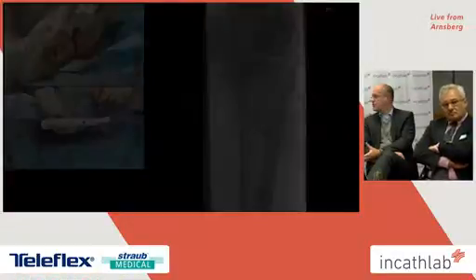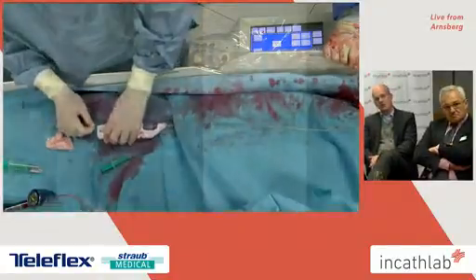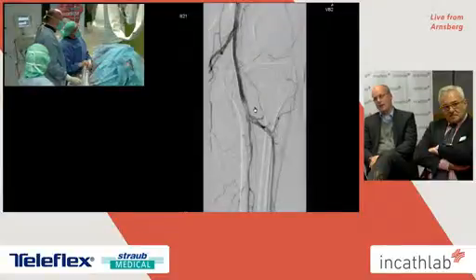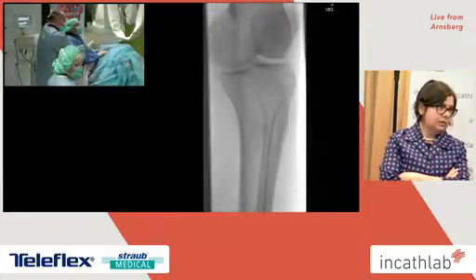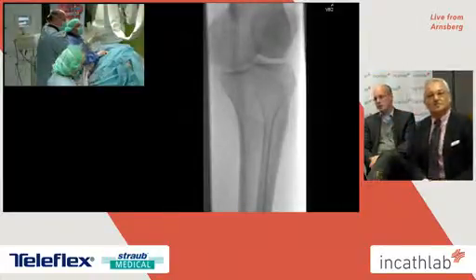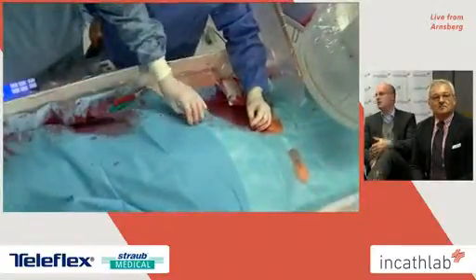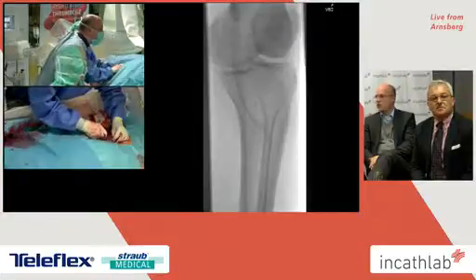It's a different principle, and this is a real screw which is inside the spiral and inside the catheter, which takes it out. So compared to other atherectomy devices, this is the one you're using routinely below the knee. Below the knee, because it has a diameter of 1.8 millimeters to 2.2 millimeters. So it's not a good option for SFA.